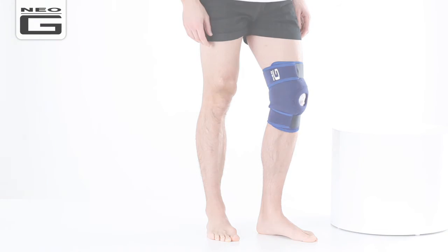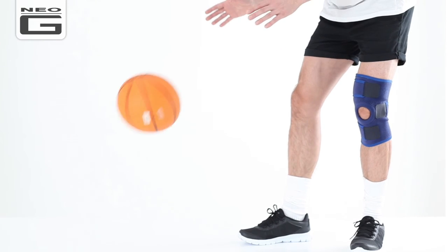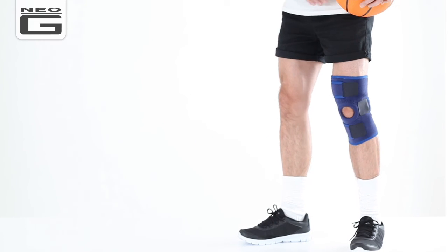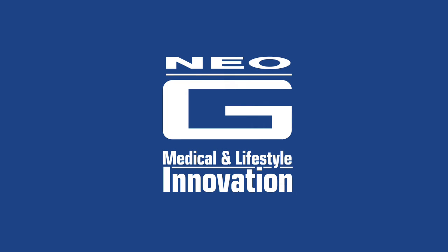Finally, replace the top strap ensuring a comfortable, secure fit. Hot and cold therapy should be used for no longer than 10–15 minutes at a time and the protective sleeve must be used at all times.